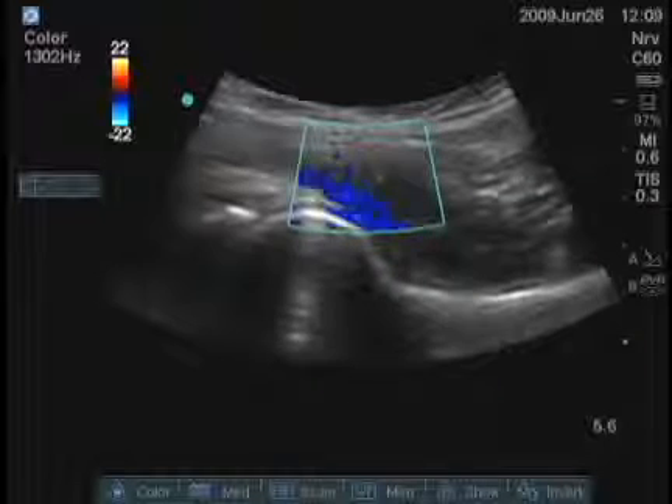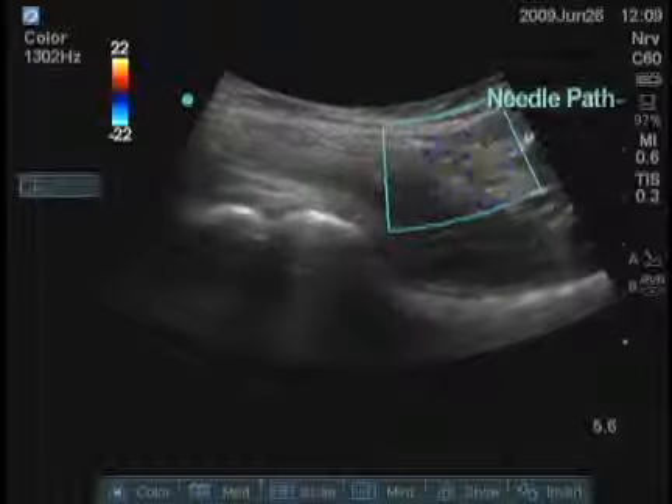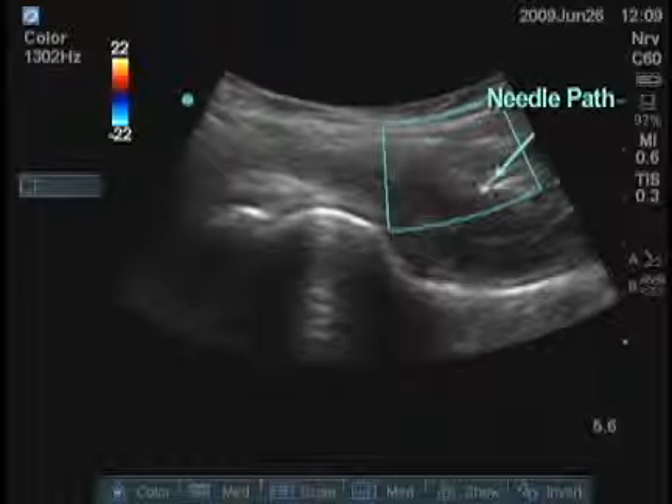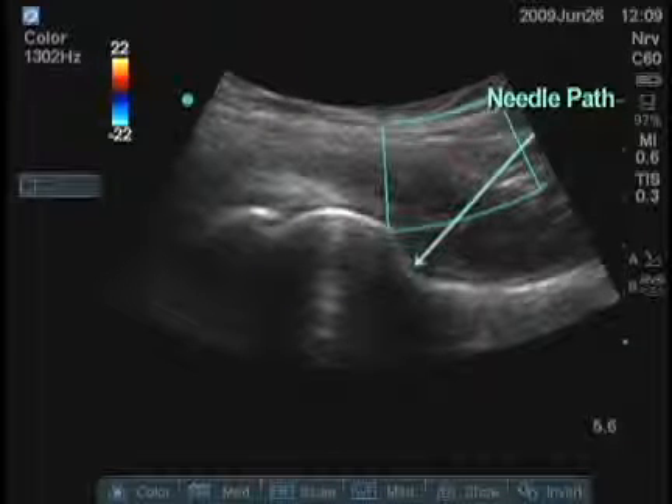Sometimes it's a good idea to look in this area, because that's the direction the needle is going to be coming, to make sure there are no branches of the femoral artery or vein going in that direction.